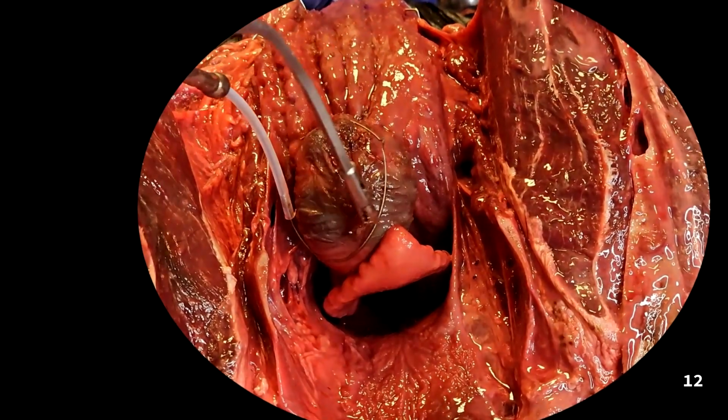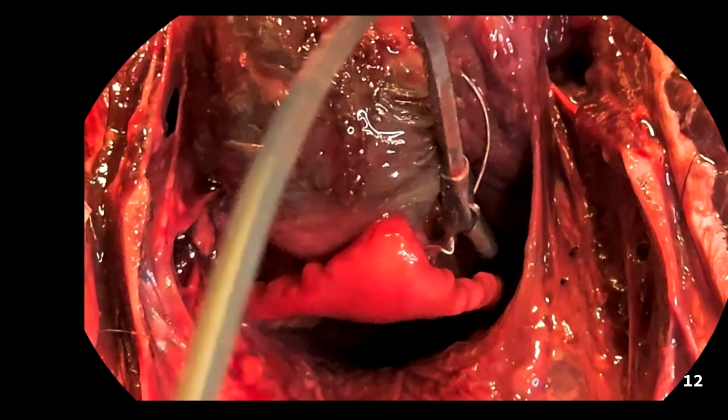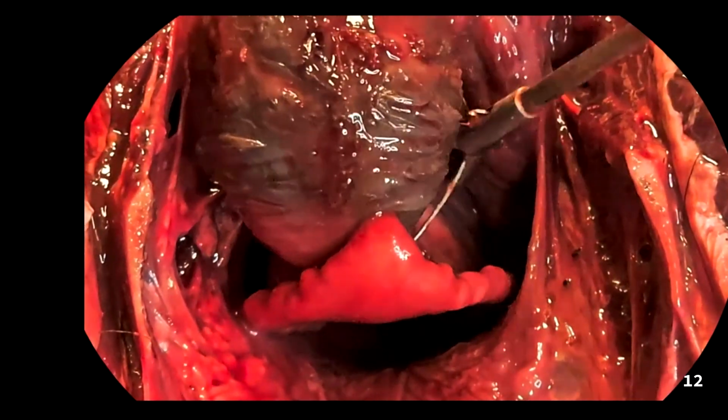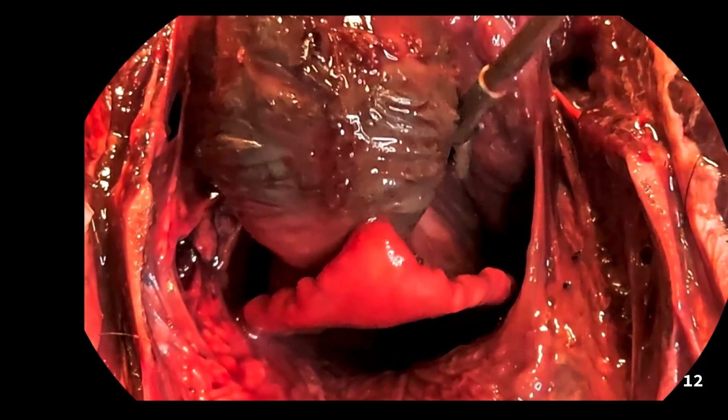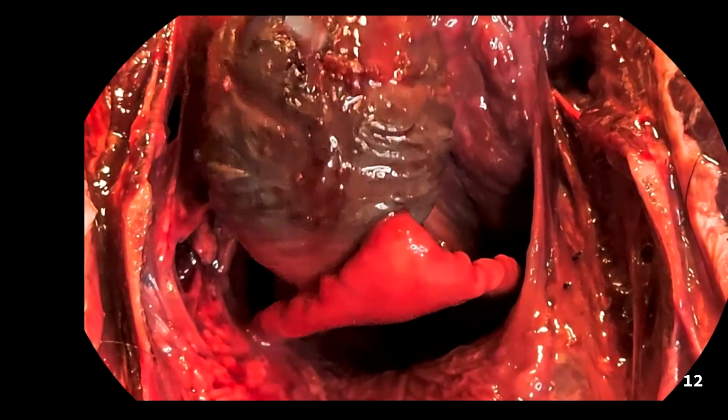Use the lowest effective cautery setting to minimize the risk of thermal injury to the mucosa and surrounding tissues. We started at 100 watts using bipolar electrocautery through the snare in blended cut mode, adjusted as needed, at intervals of 5 to 10 seconds until the mass is separated from the underlying base.